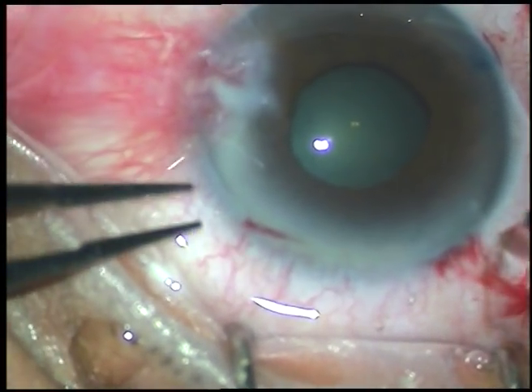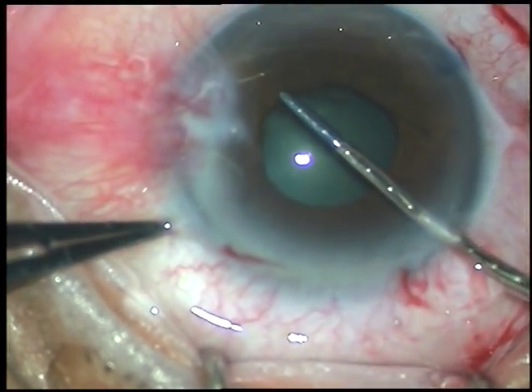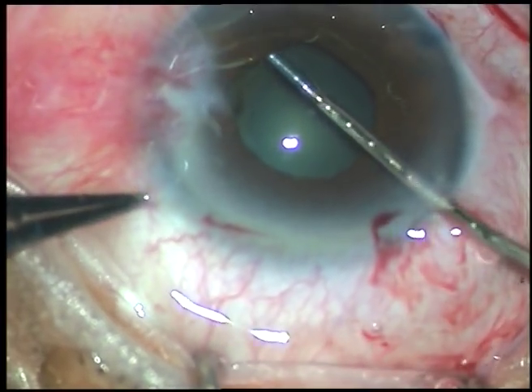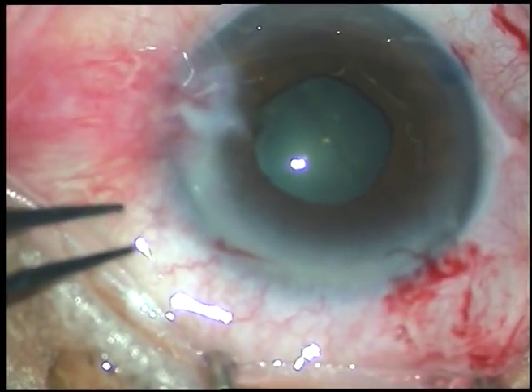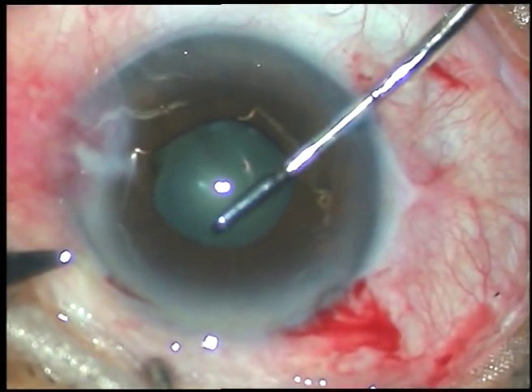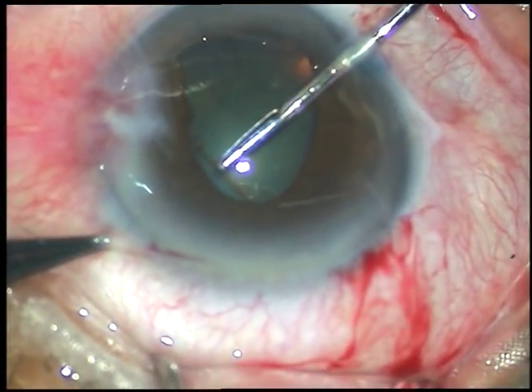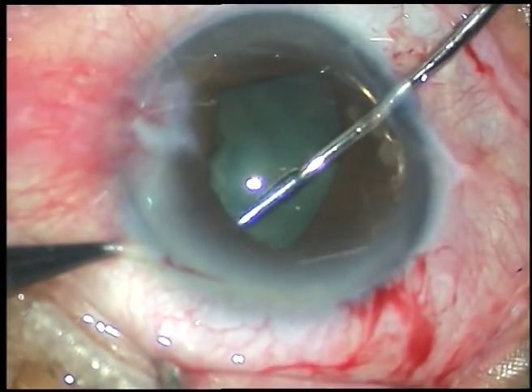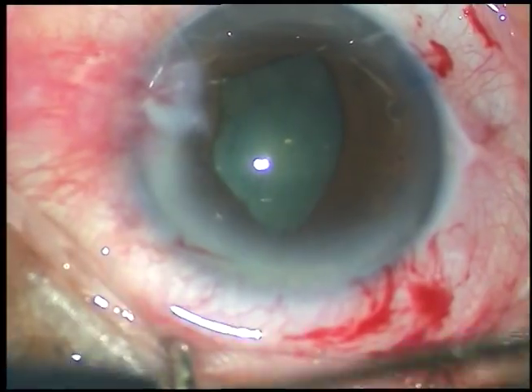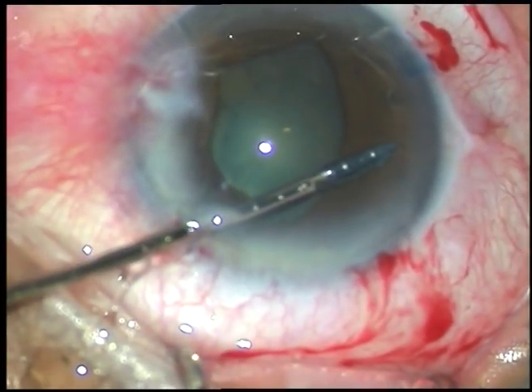All the incisions have been made and the capsule has been stained with trypan blue dye. The device has been taken totally into the anterior chamber and the leading flange has been tucked. Now I go through the right side port, hold the flange at 1 o'clock and tuck it underneath the iris. B-Hex is a hexagonal pupil expansion device and you tuck the alternate flanges.